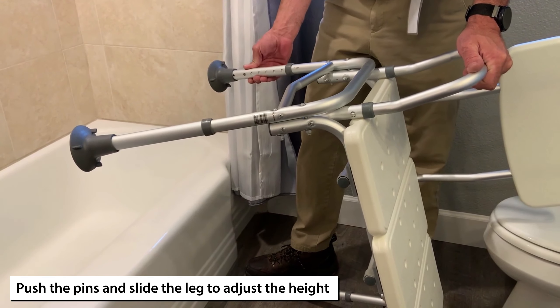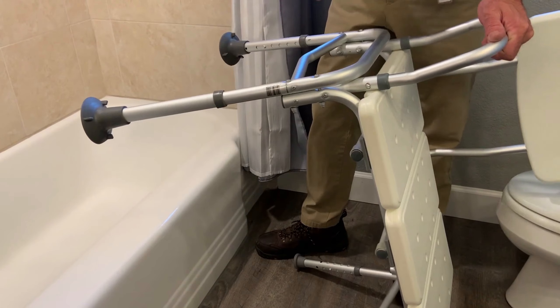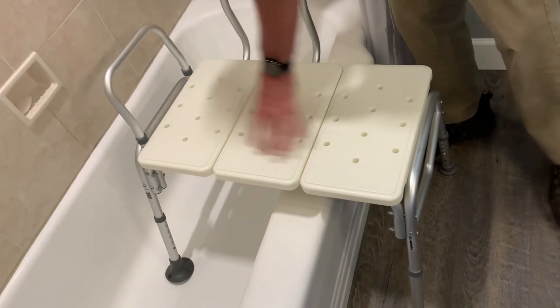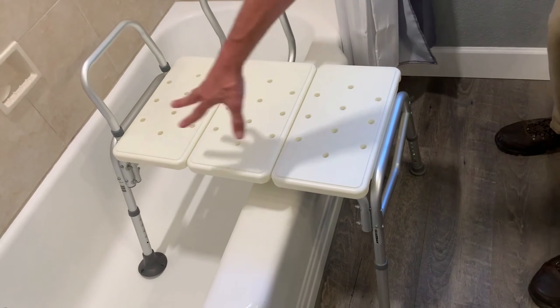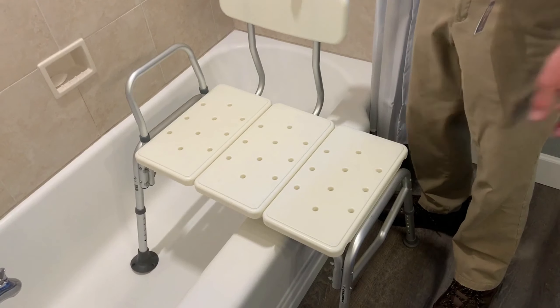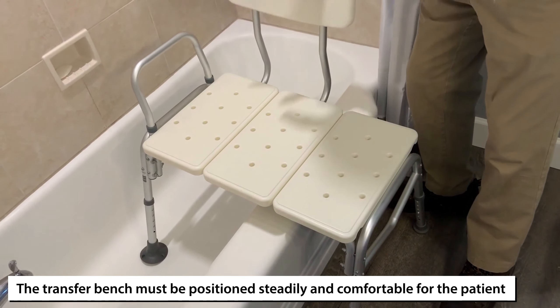Adjust the legs by pushing in to slide them up or down. You may have to fine-tune a little bit — everybody's bathroom is going to be different. You just want to get it to where, when it sits in there, it's stable: not going back and forth, no legs off the ground, all four legs on the ground both in the tub and outside.